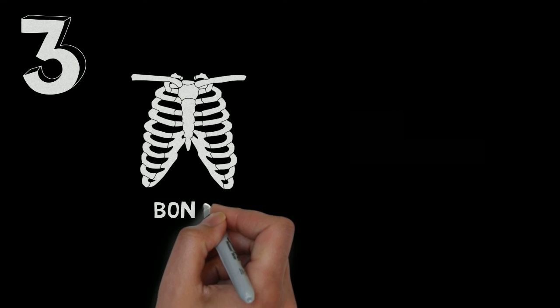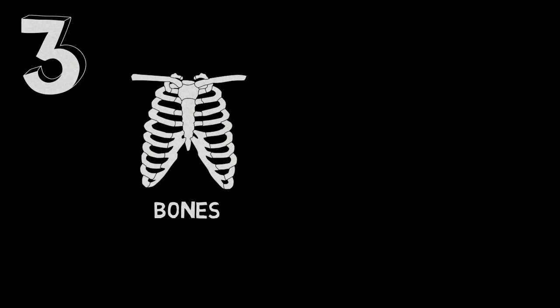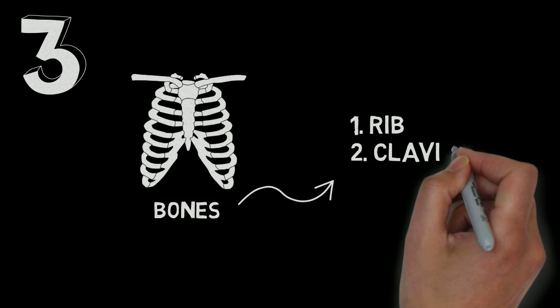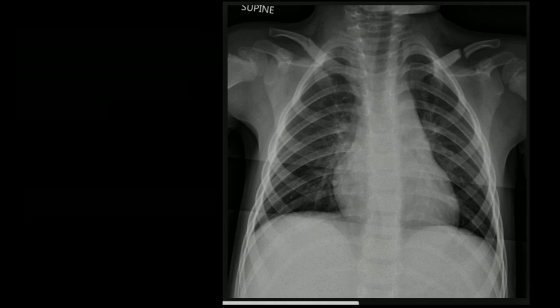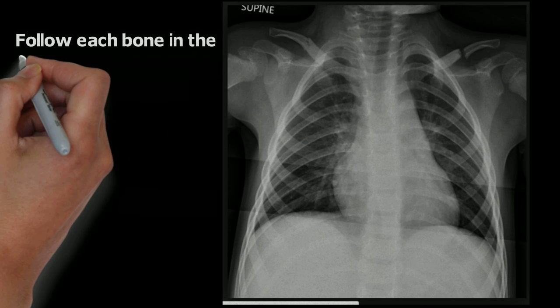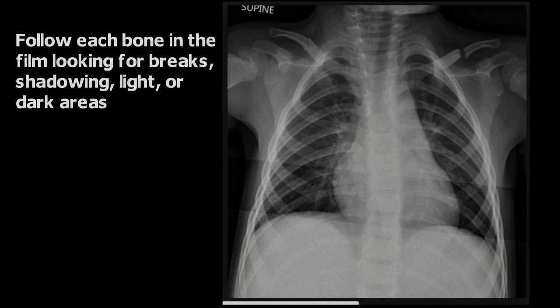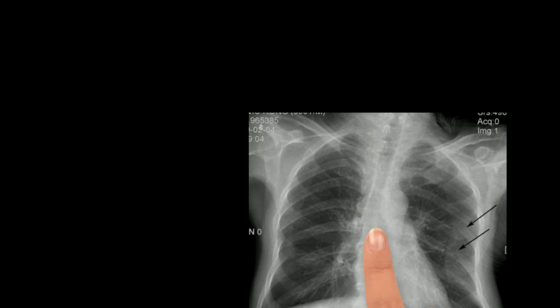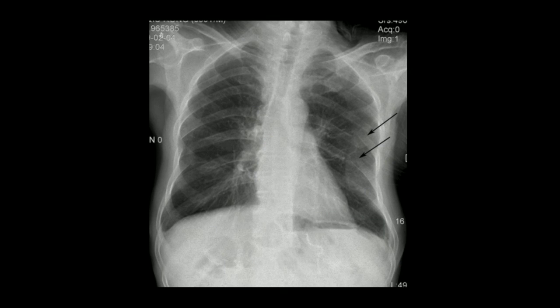For the third and final step of the Peekaboo 432 method, you should focus your attention on the bones. Scapular fractures are pretty much unheard of in primary care, so I would focus on the ribs and the clavicles. You'll want to follow each bone, right to left, up and down, to make sure there's no break. The bone should be smooth, without lesions or lighter or darker areas. Hopefully you were able to see the left clavicle fracture up here. Let's take a look at another picture to see what rib fractures look like.